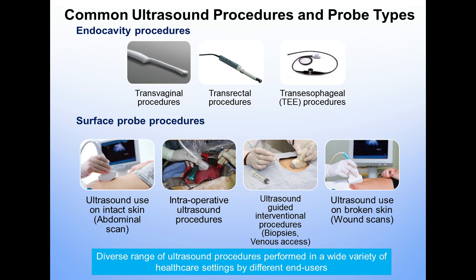And then, of course, ultrasound use on broken skin, when some of the clients who have wounds and scars also have some ultrasound procedures done there. So there's a diverse range of ultrasound procedures, and they're performed in a variety of healthcare settings by different end users.